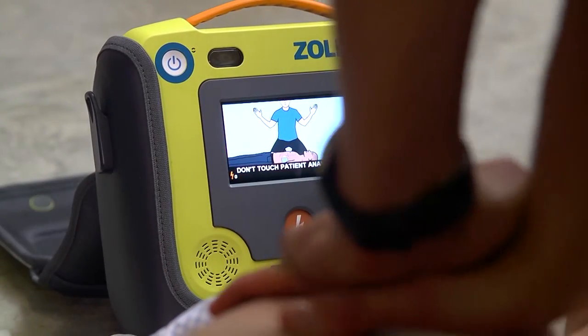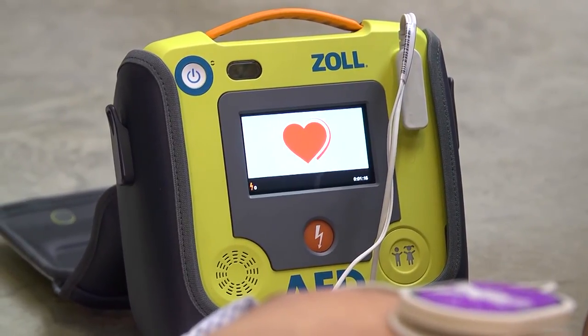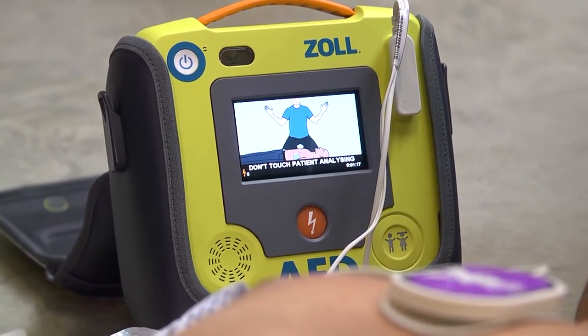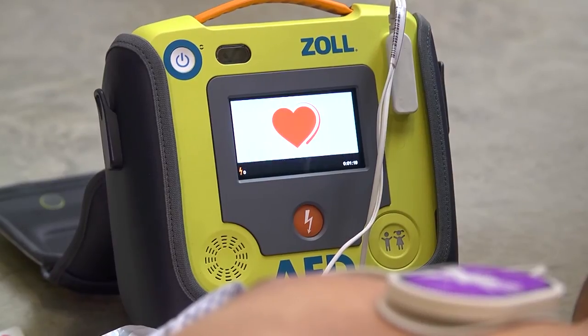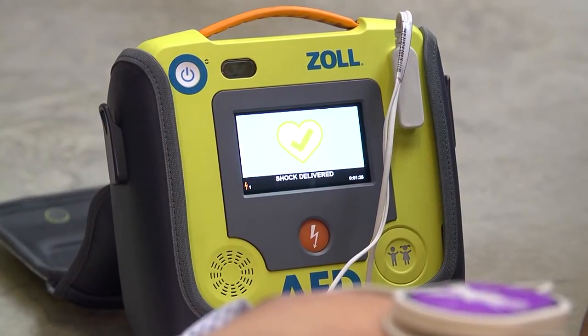Don't touch the patient. Okay, stop CPR. Okay, everyone's stacked is perfectly safe, okay? Don't touch the patient. Analyzing. Shock advised. Shock advised. Everybody stand clear. Don't touch the patient. Shock delivered. Carry on CPR.